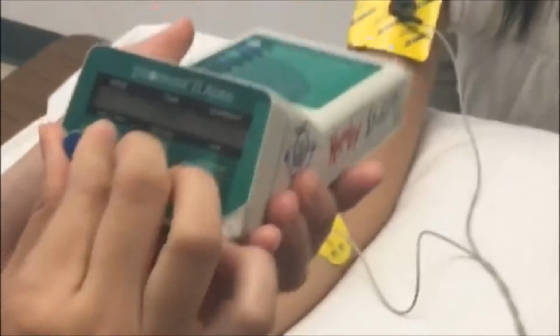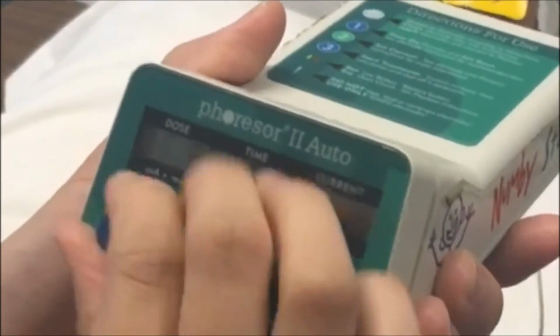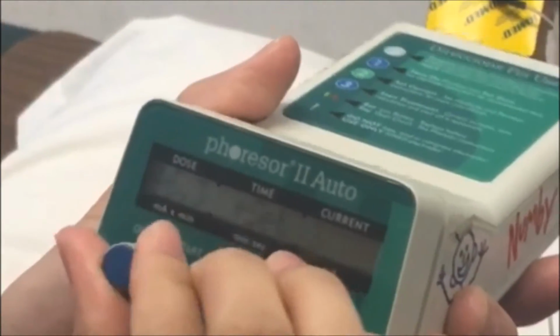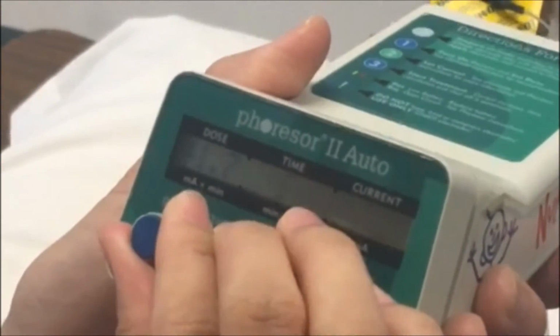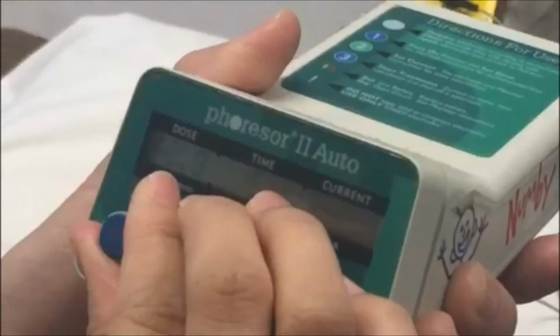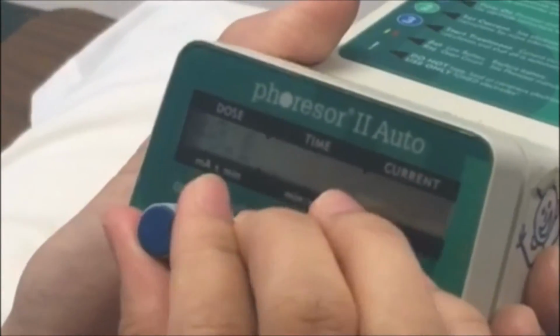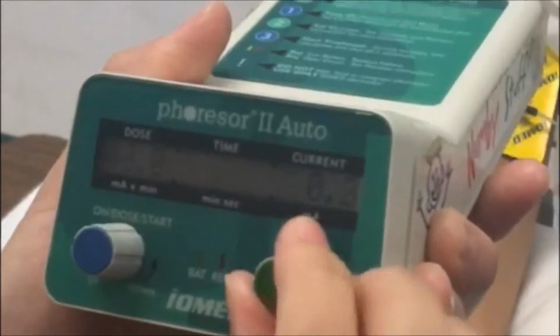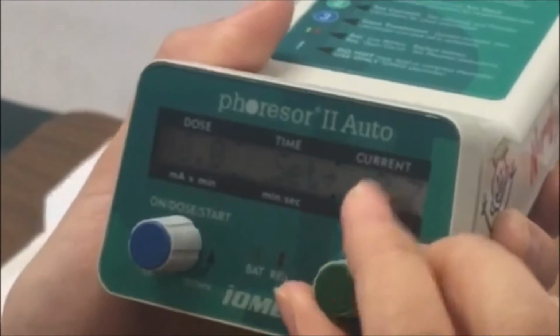So start with 40 milliamp minutes. Not too much. Alright, so the current is going to be 4. If it's a 4 current, then it's going to take 10 minutes.